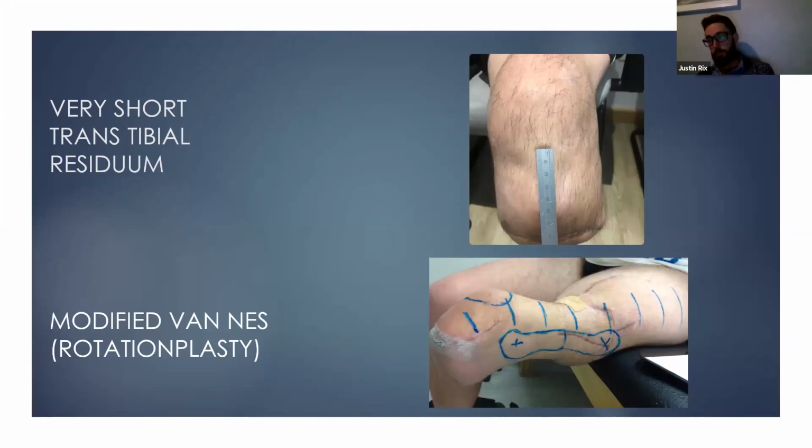It's made a very big difference to the patient, as she didn't have to worry about a seat for the ischium to sit on, as well as it allowed us to get our knee centers more level, which was a huge benefit for her.